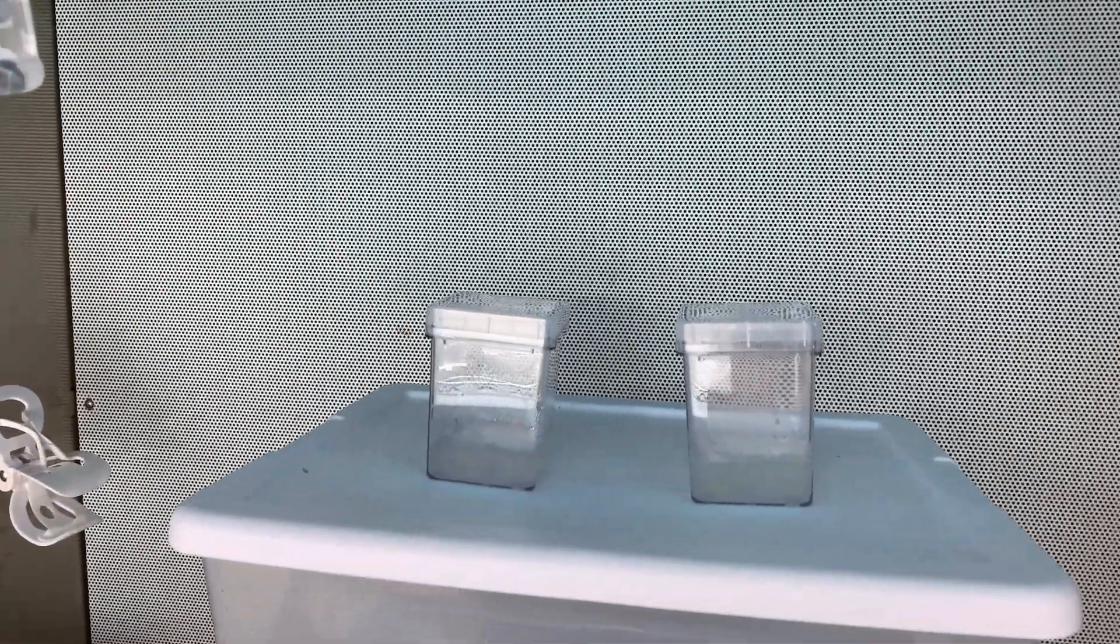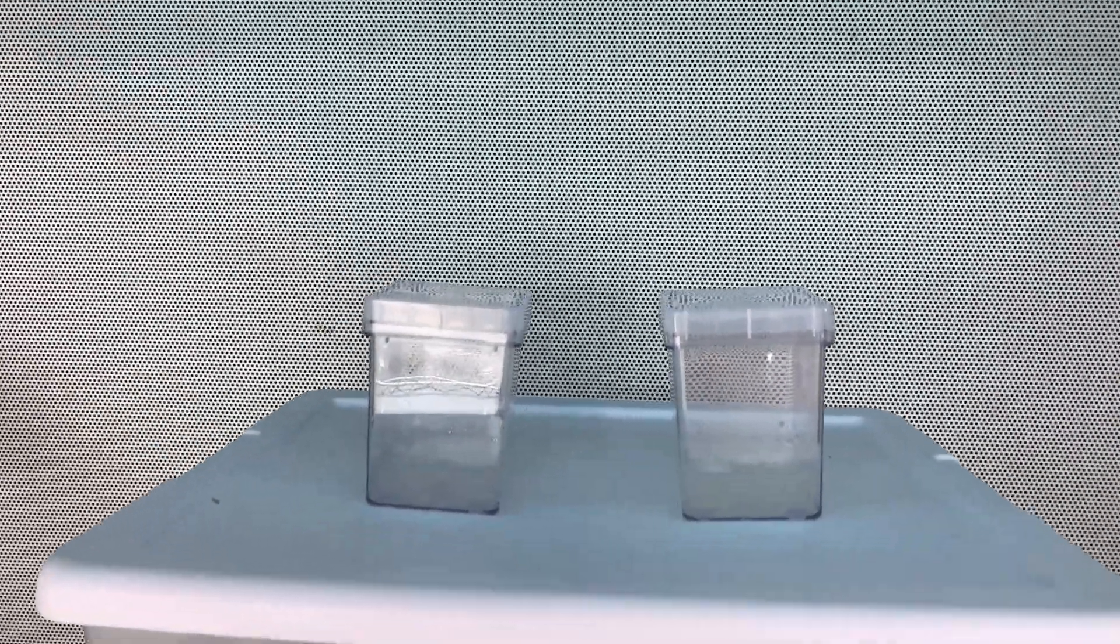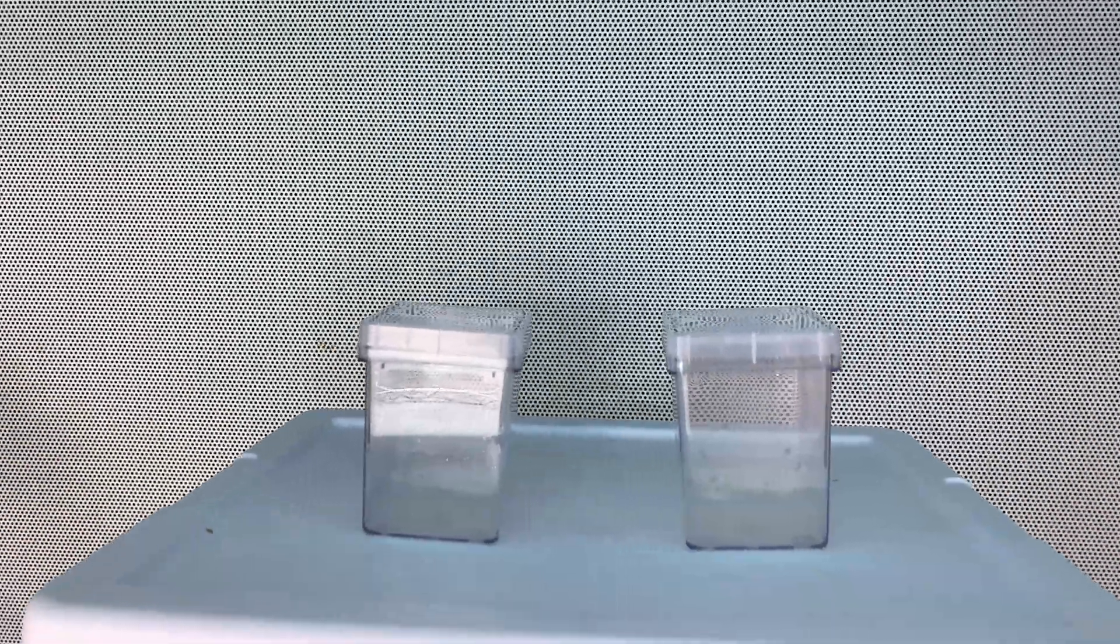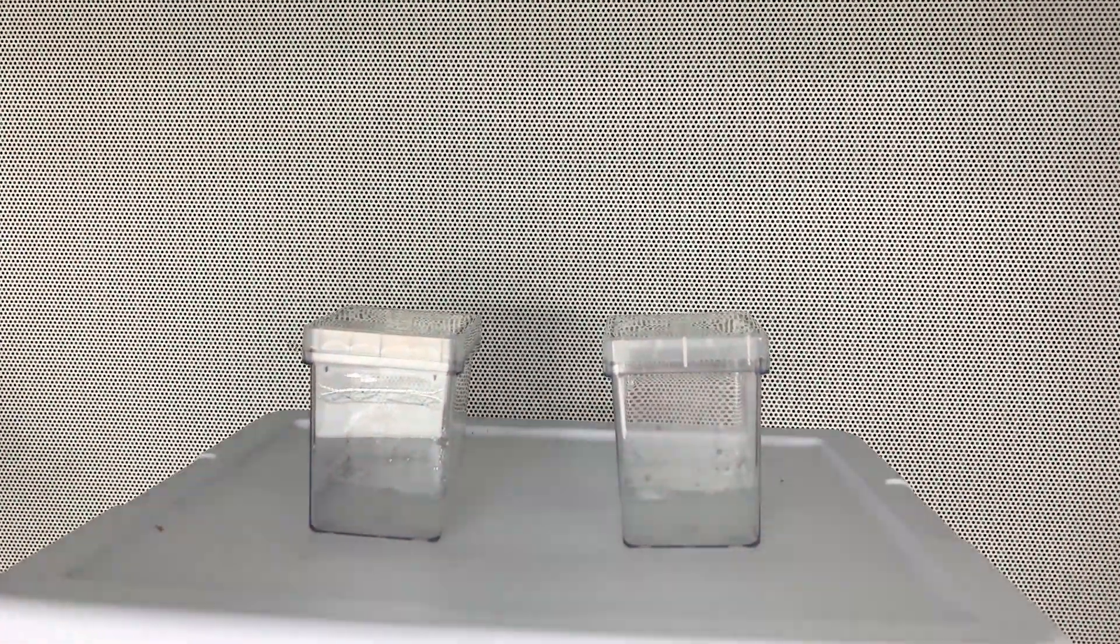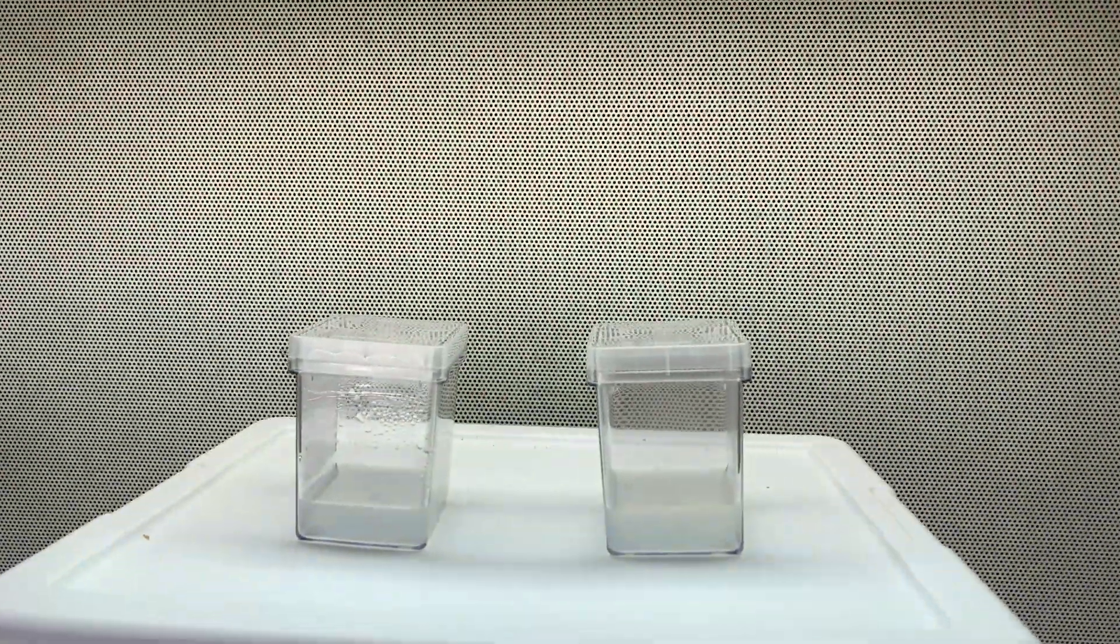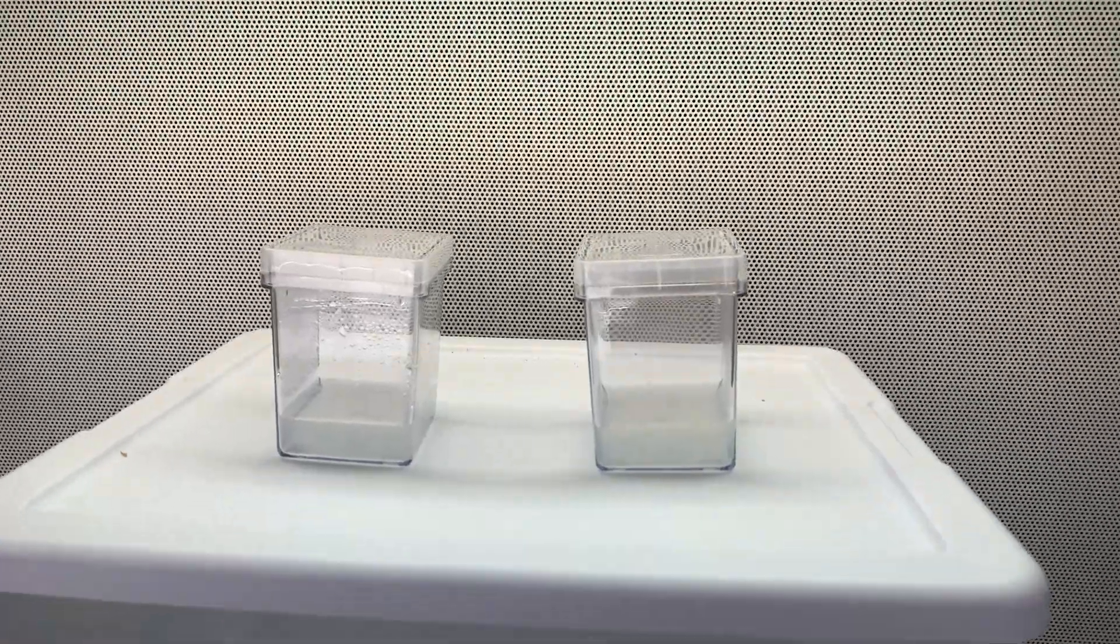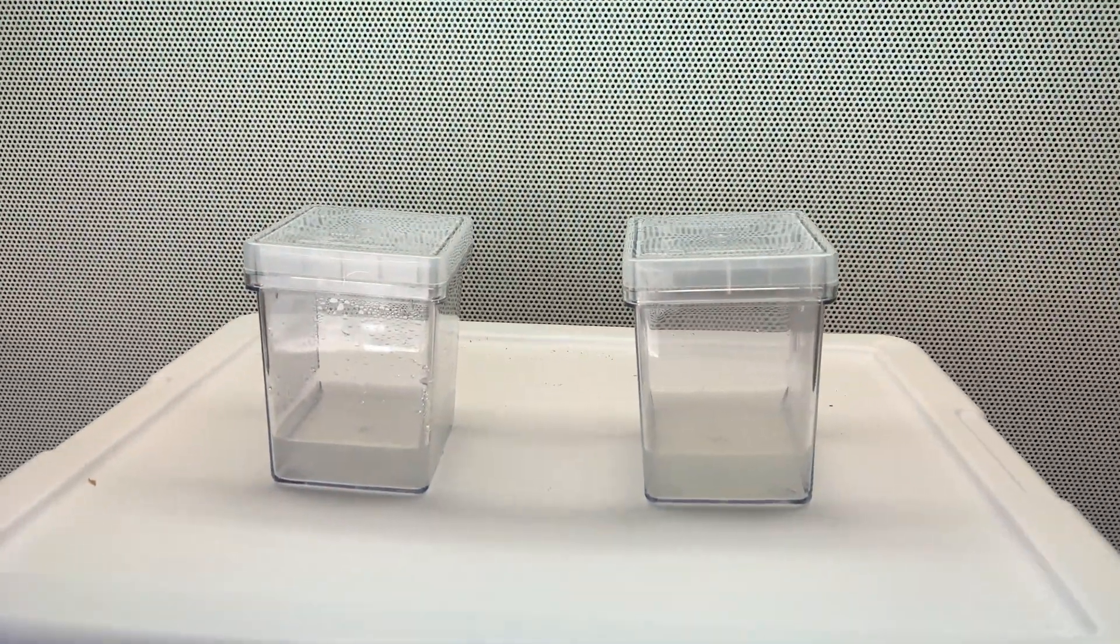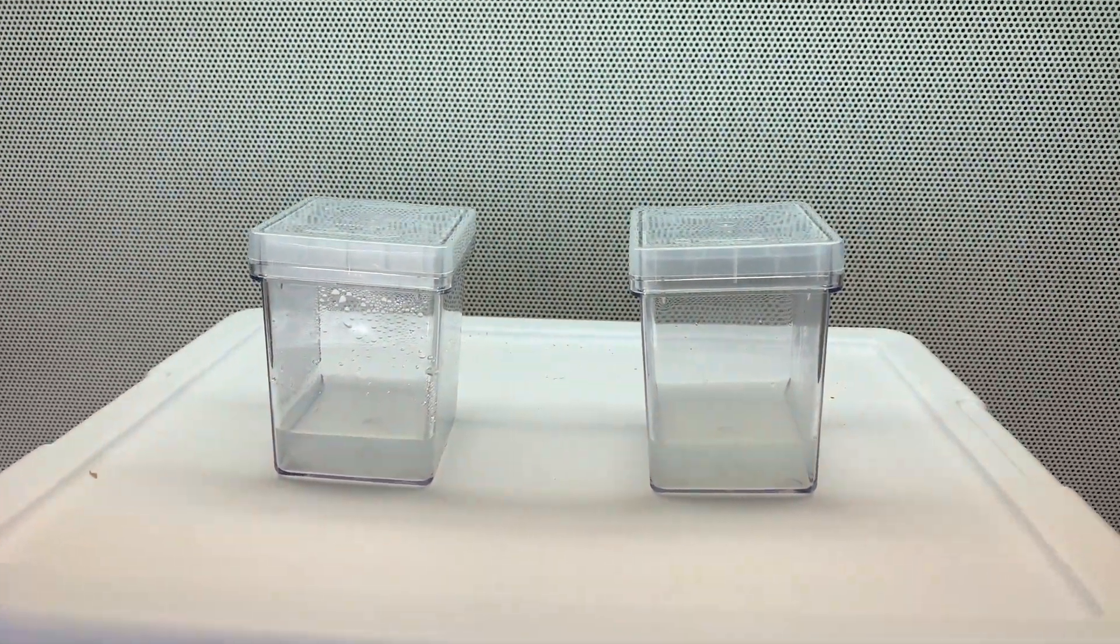All right, it has been 30 minutes and it's time to turn off the UV light, turn on the normal light. All right, and we are done for today. Tomorrow I want to add some plants and let's see what happens.